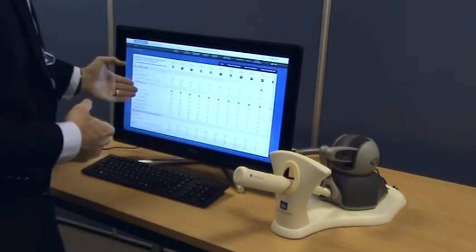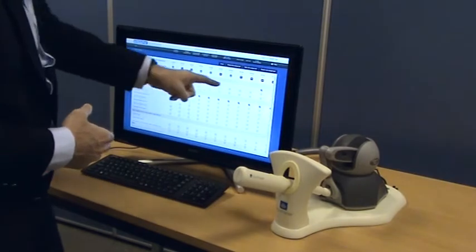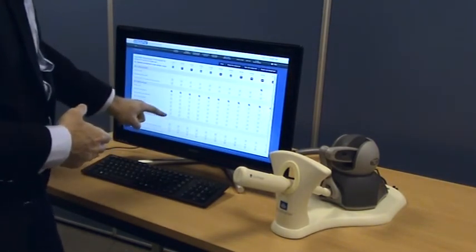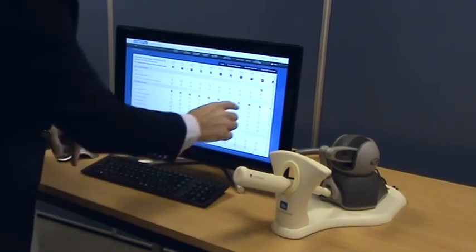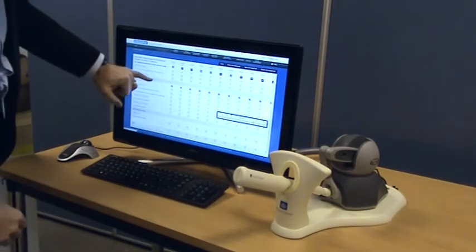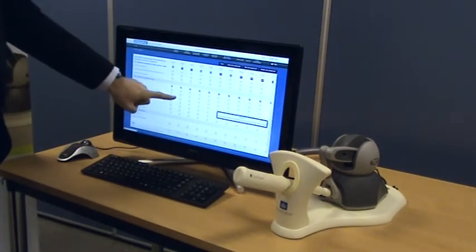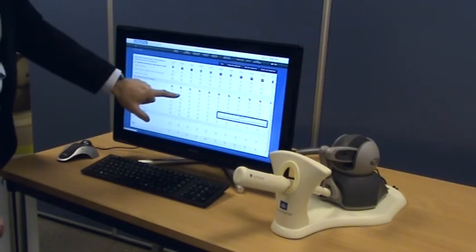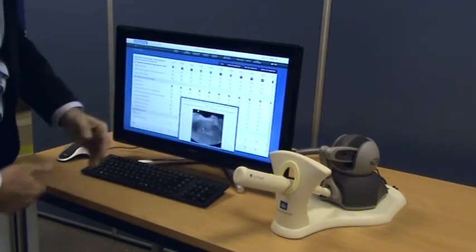So you can see here the history of my attempts at doing the optimal assessment uterine cavity, and you can see that I passed the module. If you look at the one I did yesterday, you can see how every level of task that I've done is given with a tick or a cross to give me feedback. If you get any cross, when you click on it, it will bring up exactly why you failed.